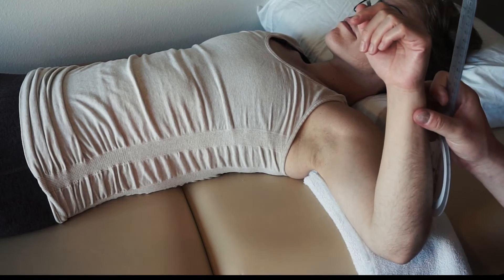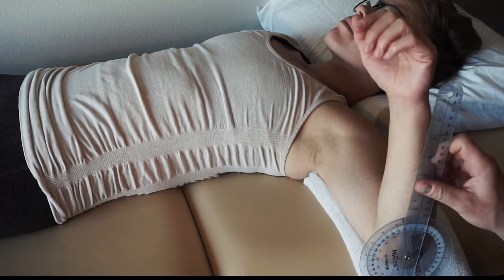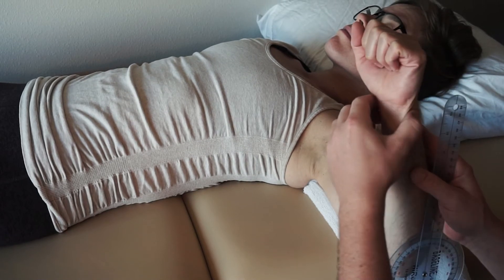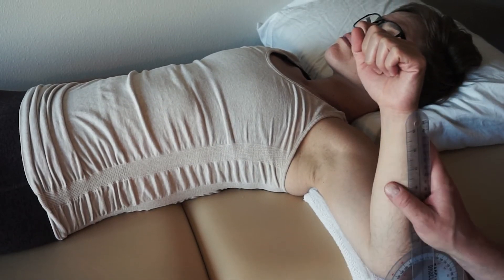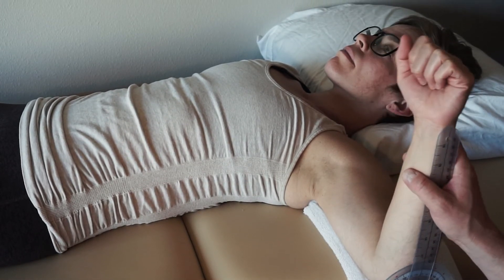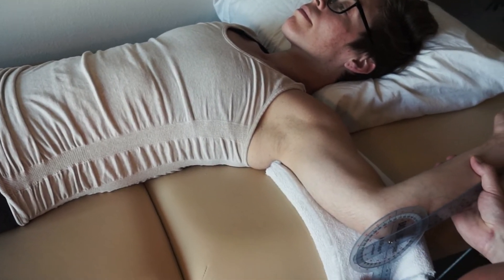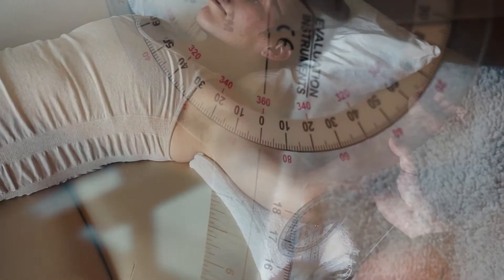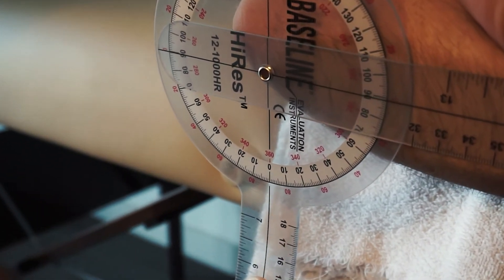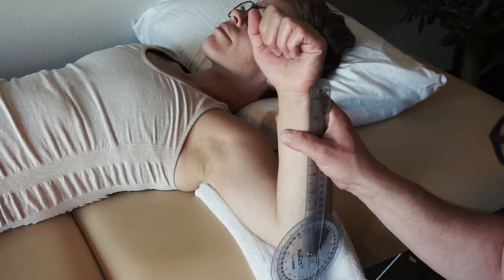The fulcrum is the olecranon process on that ulna. The stationary arm is going to be perpendicular to the ground, and the moving arm is going to go up to the ulnar styloid process. Line those up, then she's going to externally rotate. She's 84 degrees actively. I'm going to push and find that end-feel — went past 90 — that's firm right there. 95 degrees of external rotation passively.